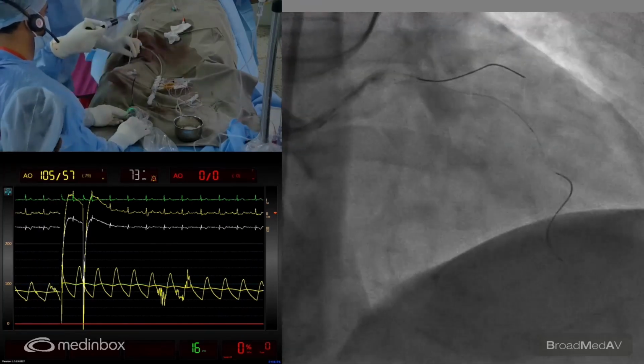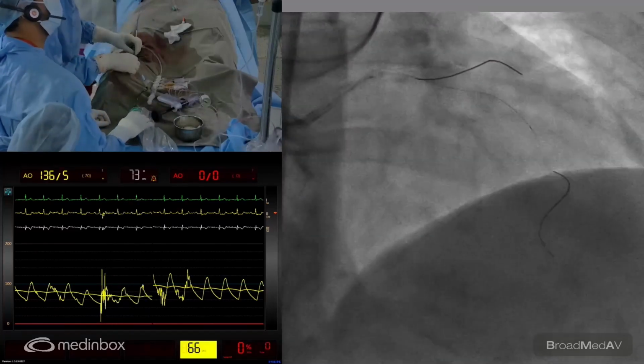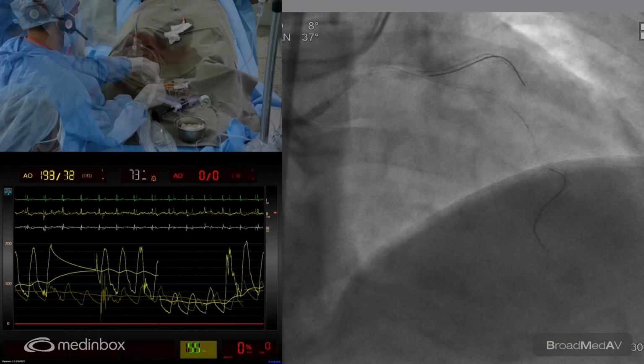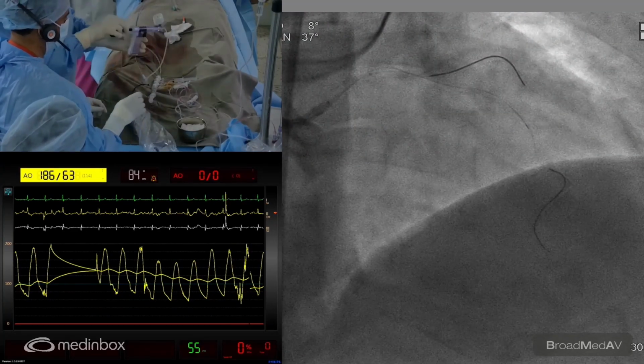Pressure is dropping, sir. We have to wait a little bit, sir. Deflate, sir. A second, and we deflate. Okay. So now I'm going to change the direction of the catheter. A little bit further. Okay, that's good. Okay, now we're going to go up again.